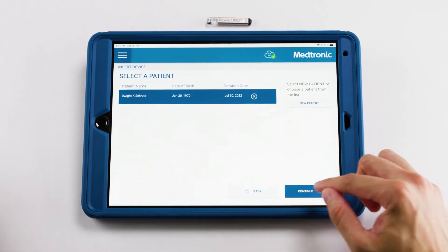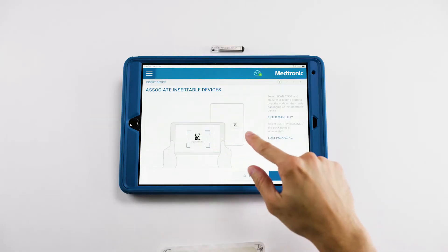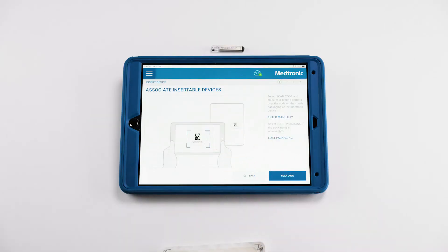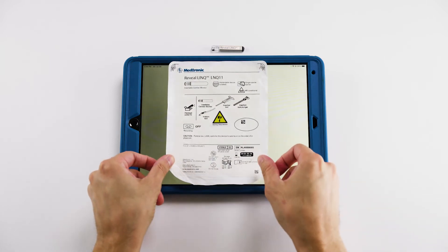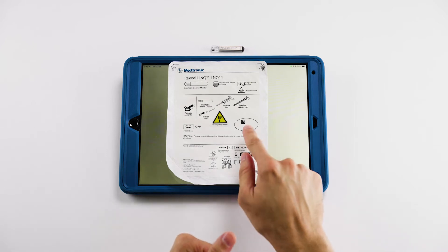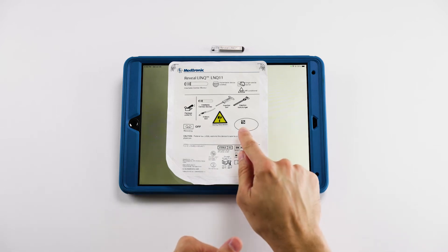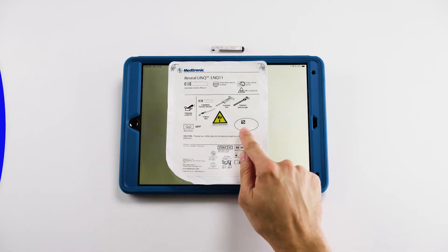We can select it and hit Continue. Next, you'll be prompted to associate the device with a patient. To do so, you can hit Scan Code and, using the camera of the tablet, you can locate the QR code on the back of the Medtronic RevealLink packaging.